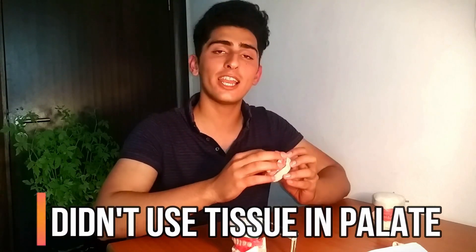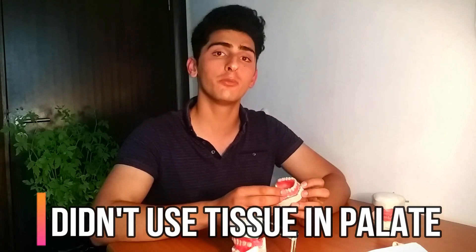The first mistake I made was not using tissue in the palate while working on tooth placement. When you're moving big chunks of wax and even little pieces, they keep dripping down into the palate. If you have tissue in the palate, it prevents the wax from dripping in there, keeping it smooth and making it much easier in the later stages to achieve the aesthetic result you need.